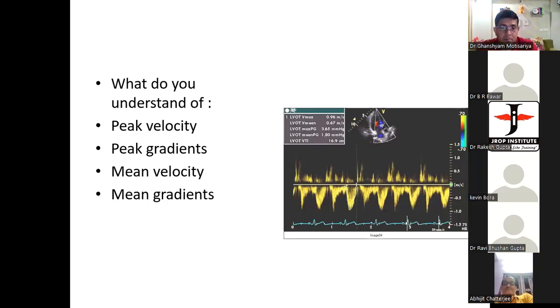Next is Dr. Chandan Mahapatra. Yes, Chandan, sir, are you there? Chandan, tell me, what do you understand by peak velocity?